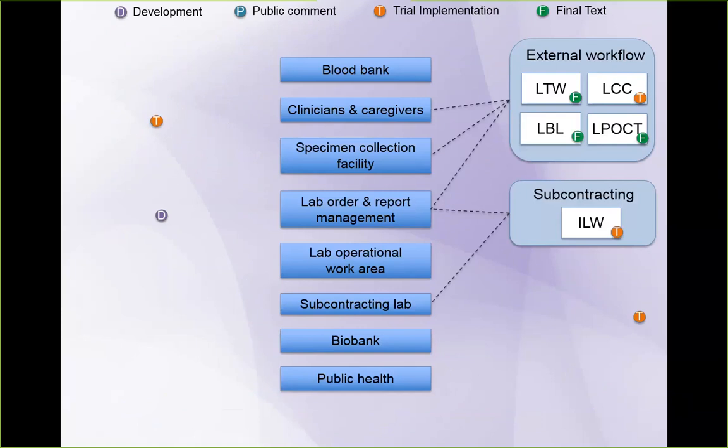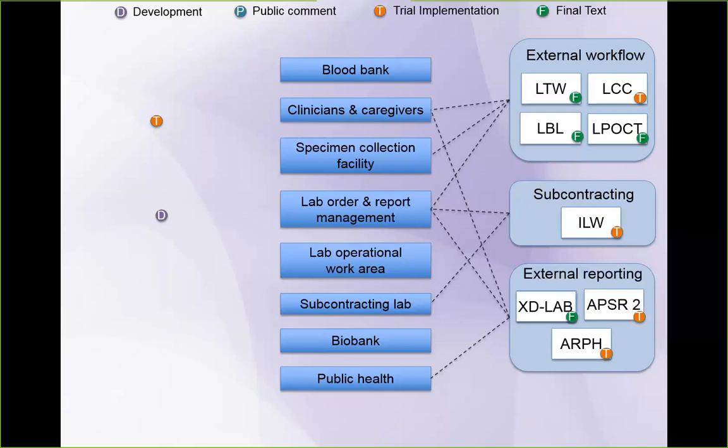And as you can see, the three of those in the external workflow are in final text, and LCC is a trial implementation. Subcontracting, that was the inter-lab workflow, so that goes from one lab to another lab. It's also a trial implementation one.